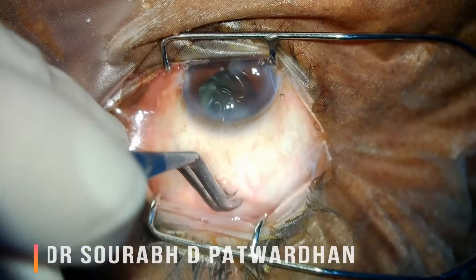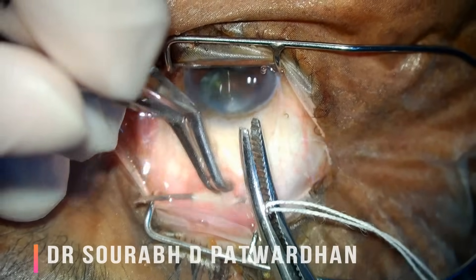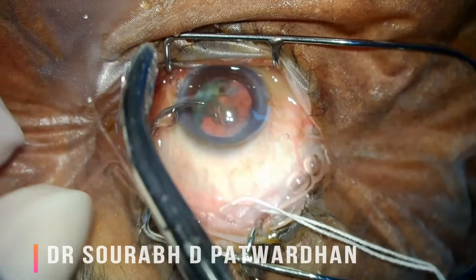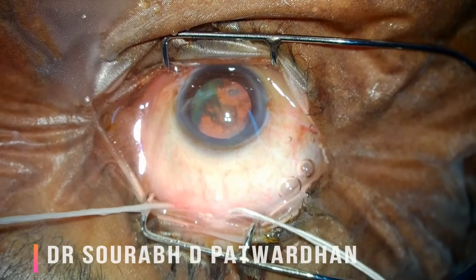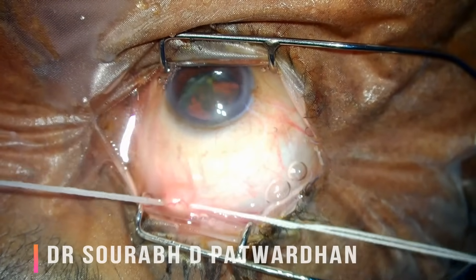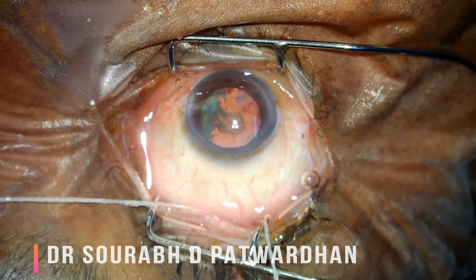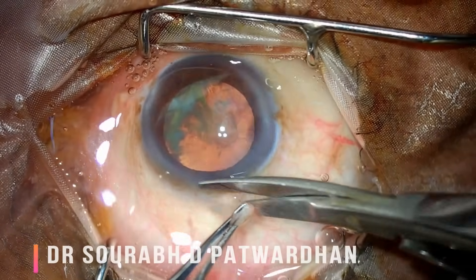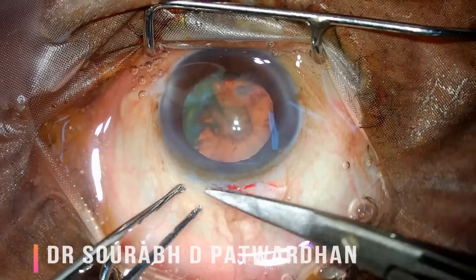Here is the first trick: taking the superior rectus bridle. Once you hold the superior rectus, the globe must turn down — that is the indication that you are holding the superior rectus, otherwise you might just catch hold of the conjunctiva and that bridle may not be of any use. This is how the superior rectus bridle is taken; it helps in rotating the globe downwards and also assists in stabilizing the globe.